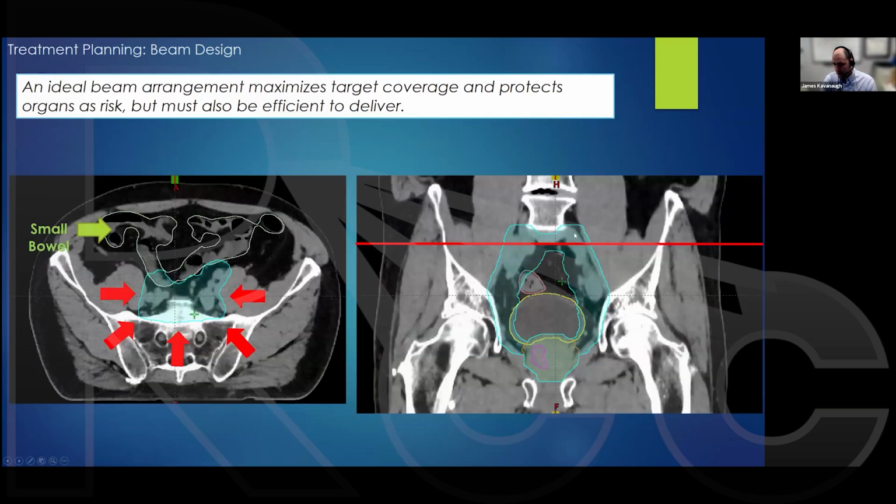Well, a couple of things to consider: having the full arcs, if you have VMAT, is super helpful because depending on where you are in the target, specific angles are more advantageous. This is where static field IMRT may also come into play, but I'll walk through 3 different levels of this particular target. At the superior border, right here, you can see that red line goes through where I'm talking.